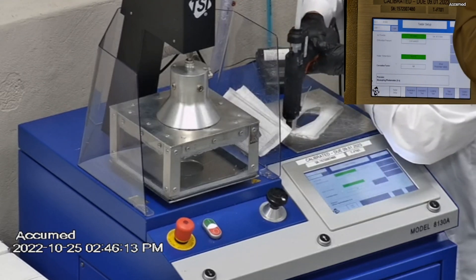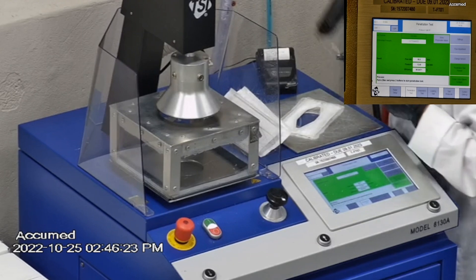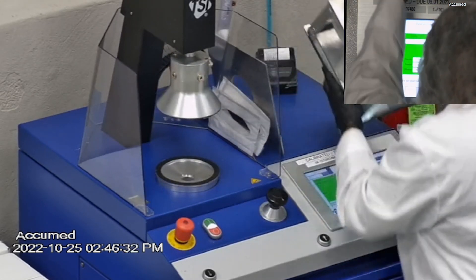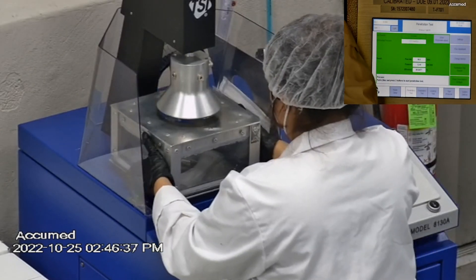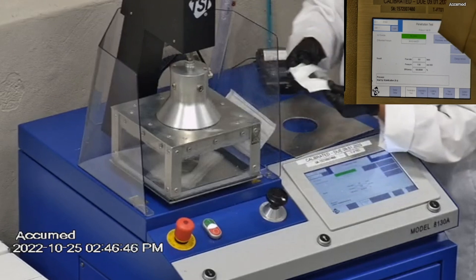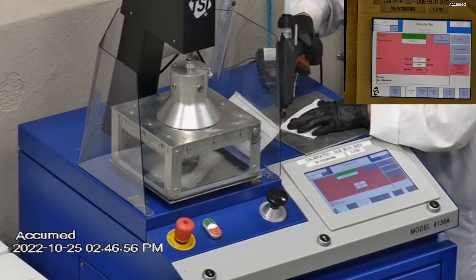The results are displayed on the TSI monitor. F stands for airflow rate, which we test at 85 liters per minute. R is for resistance, also referred to as pressure drop — this correlates with breathability, so the lower the number the more comfortable and breathable the mask is. E stands for filtration efficiency percentage.